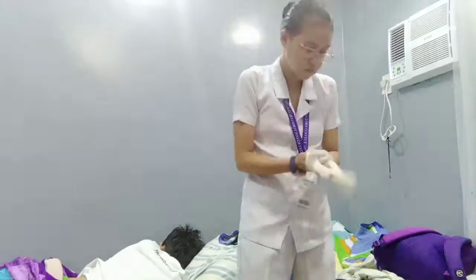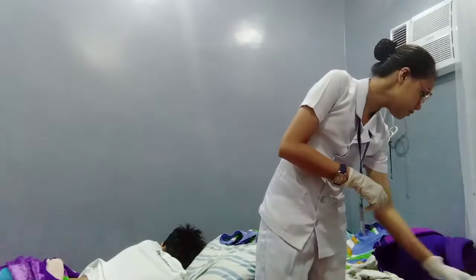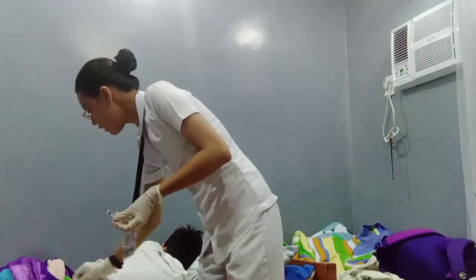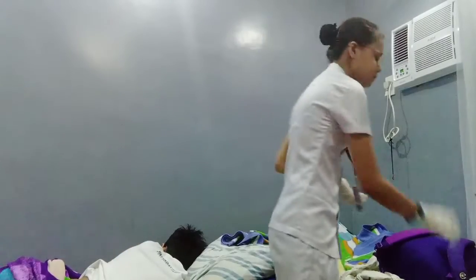Afterwards, we need to disinfect the injection site in a circular pattern from inner to outer for about 2 inches to remove bacteria and avoid contamination. Afterwards, we need to hold the gauze pad between the third and fourth finger of your non-dominant hand. Okay, since I don't have any gauze pad, I will just be using a cotton ball soaked in 70% alcohol. We need to slowly set this aside with the lid.